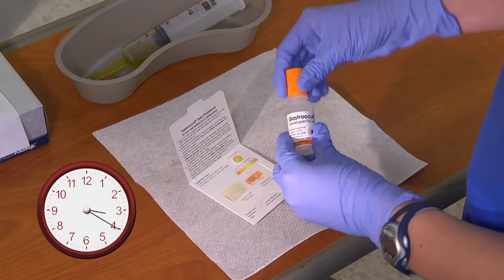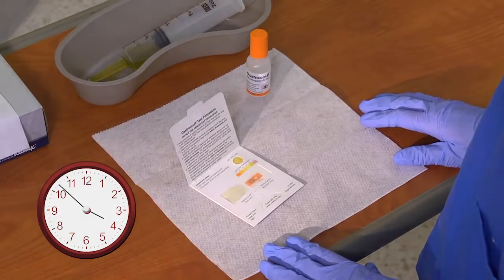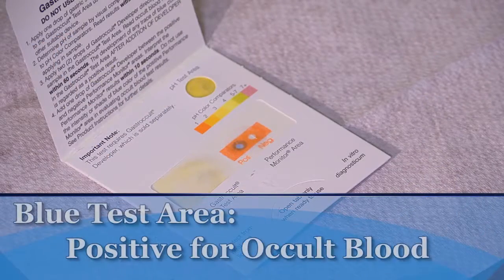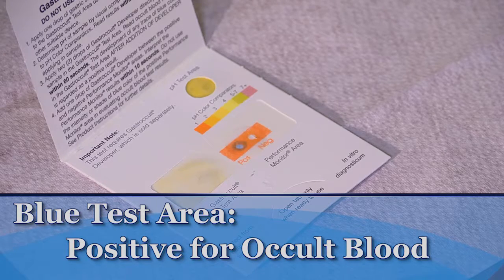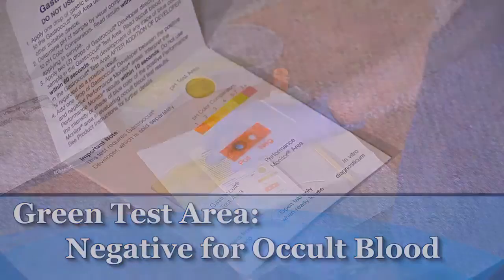After 60 seconds, compare the color of the gastric sample with that of the performance monitor. Any trace of blue in the test area is considered positive for occult blood. A green test area means the sample is negative.